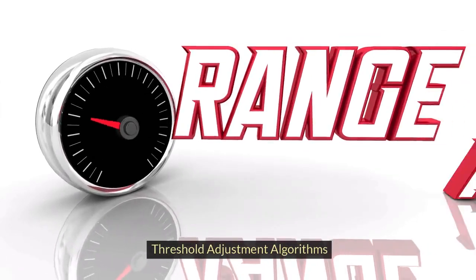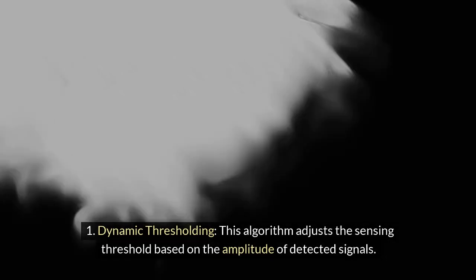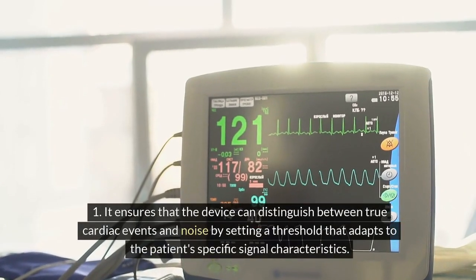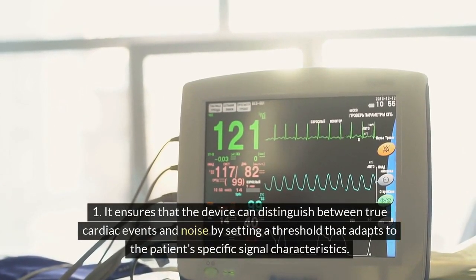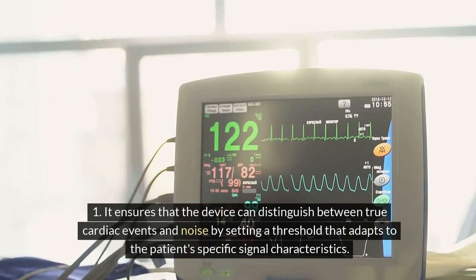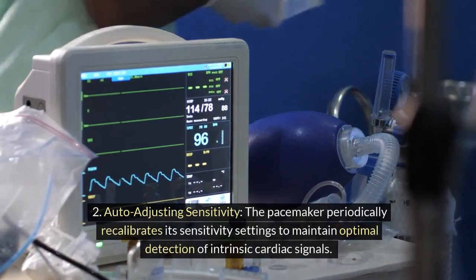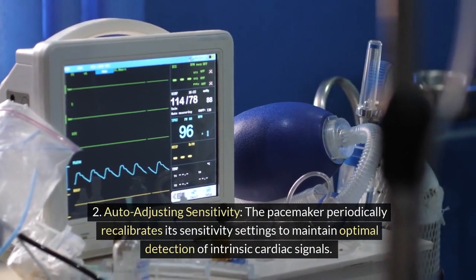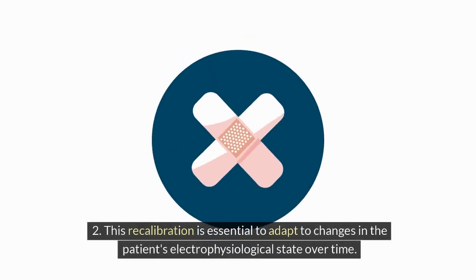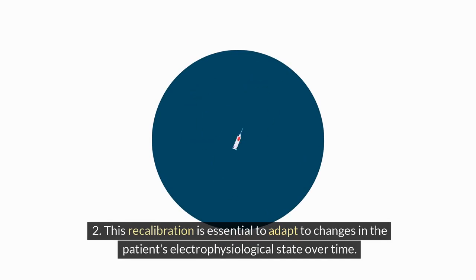Threshold adjustment algorithms. 1. Dynamic thresholding. This algorithm adjusts the sensing threshold based on the amplitude of detected signals. It ensures that the device can distinguish between true cardiac events and noise by setting a threshold that adapts to the patient's specific signal characteristics. 2. Auto-adjusting sensitivity. The pacemaker periodically recalibrates its sensitivity settings to maintain optimal detection of intrinsic cardiac signals. This recalibration is essential to adapt to changes in the patient's electrophysiological state over time.